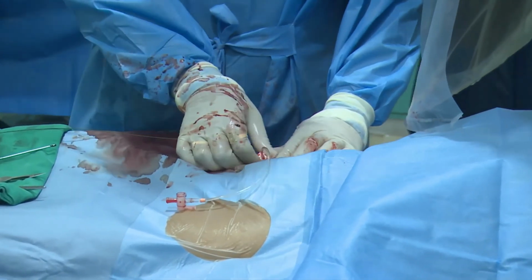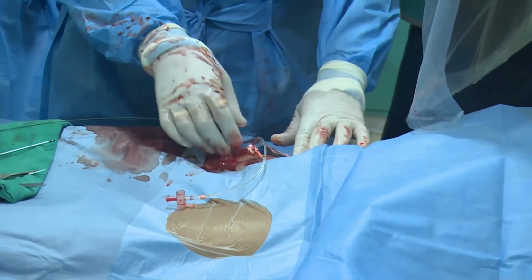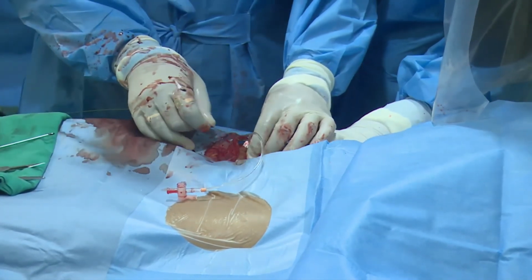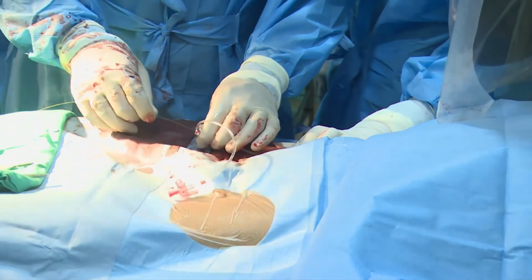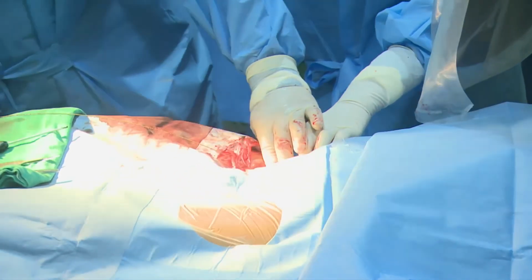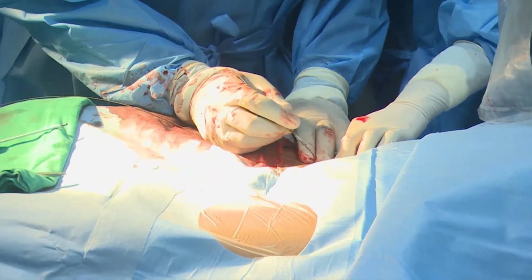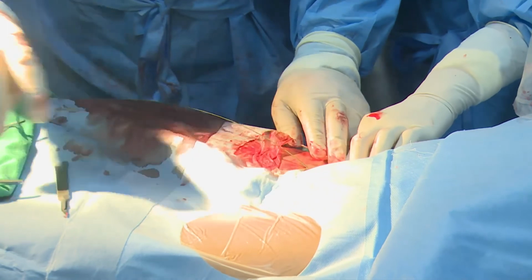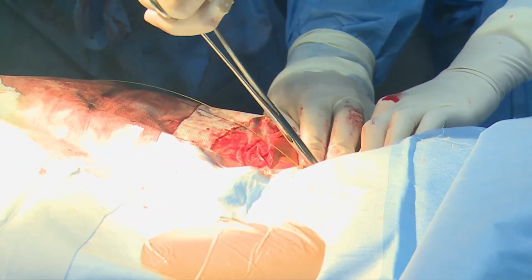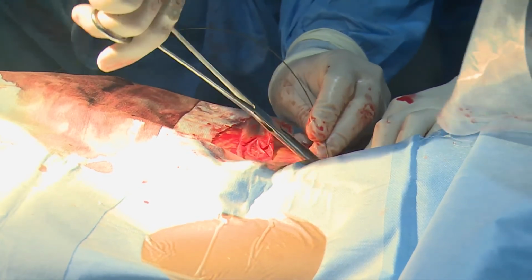And now we have taken long wire here. And can someone come here and press? Always one should have an assistant there pressing, and this step is very important. Just press it hard, okay. So this nick, there has to be good entrance nick, otherwise your ProGlide will not go, and that will be a big problem, okay. So you see we have created a good nick here, okay.